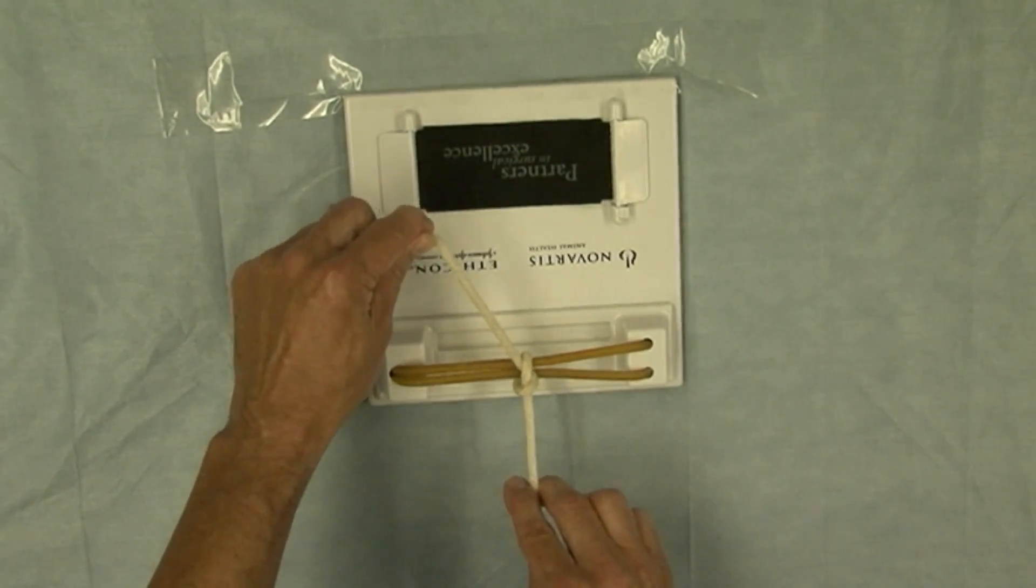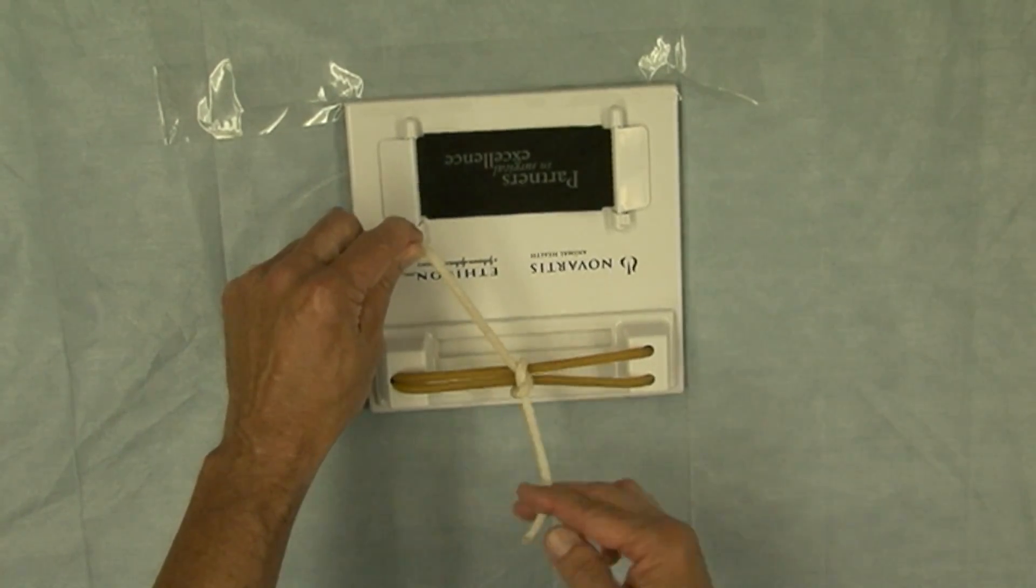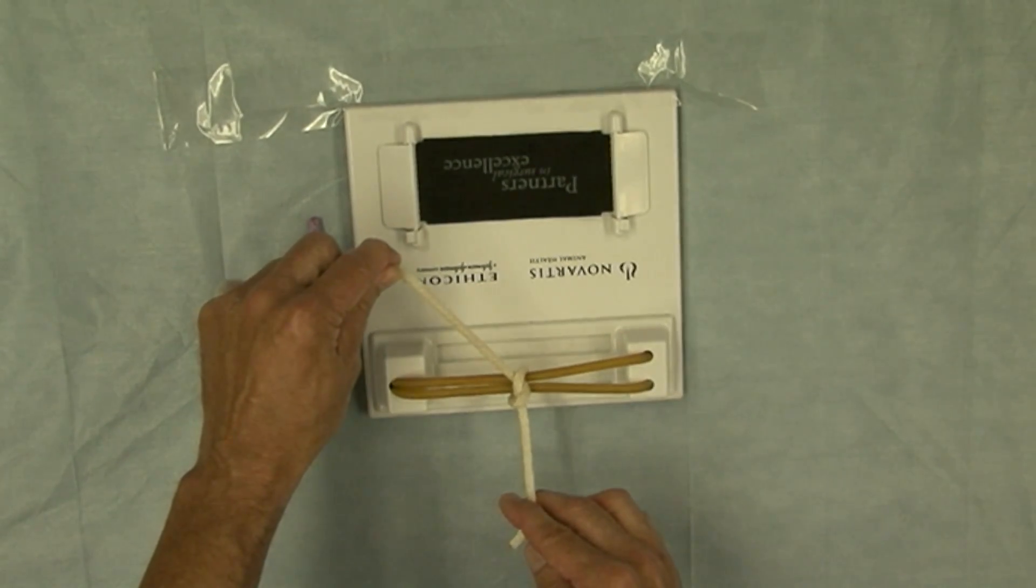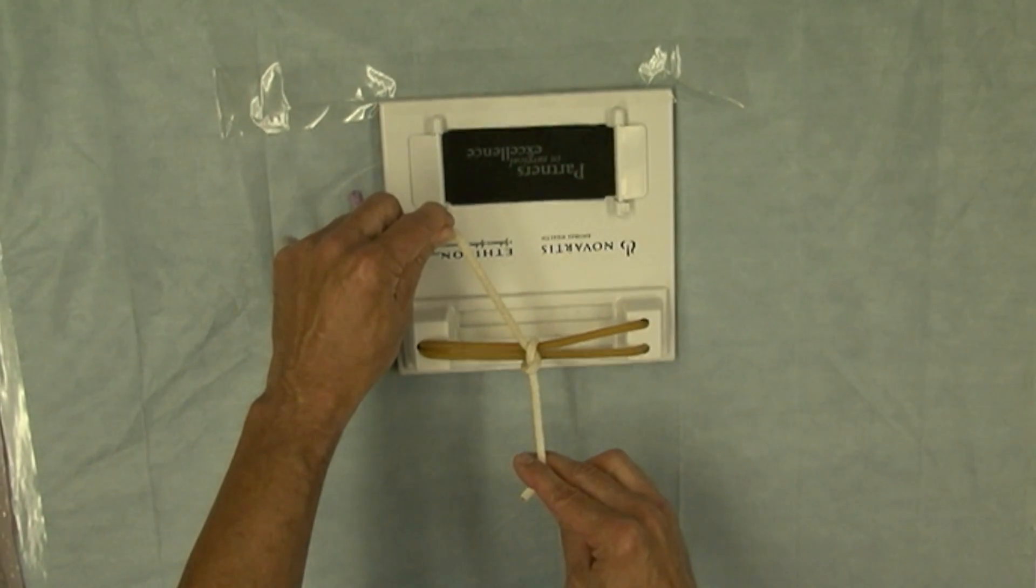Now another common mistake is being confused about where your hands start and where they end up. My right hand started away from me and now is toward me. I'm halfway through the suture pattern.